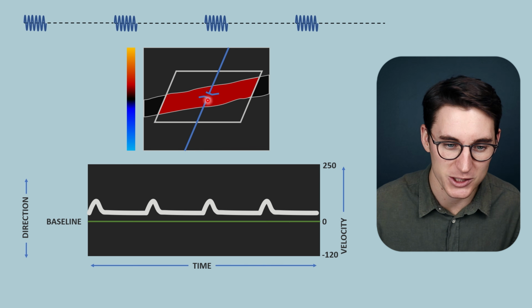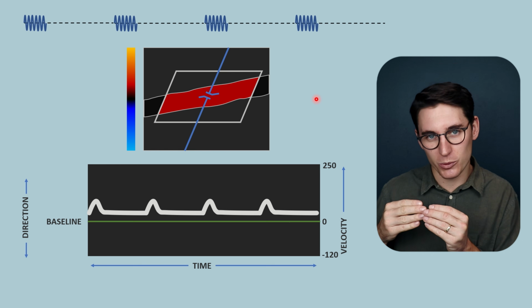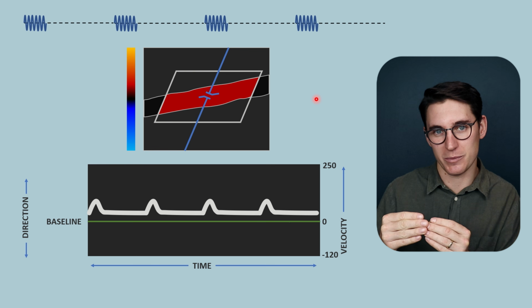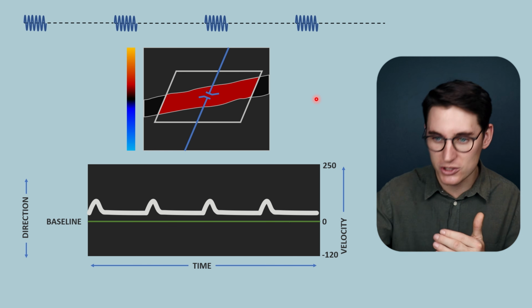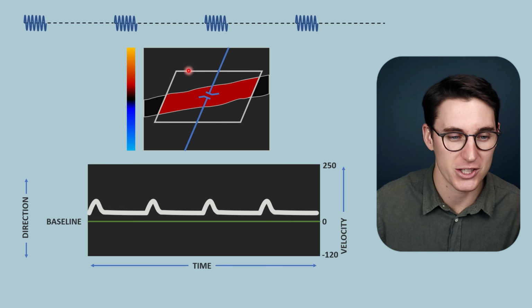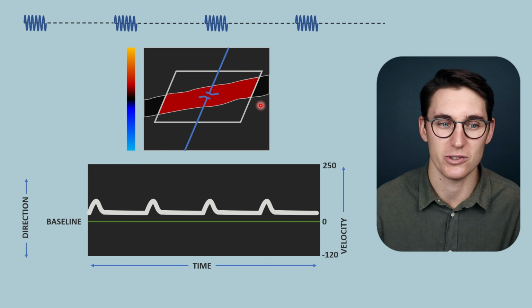So say for example this was 4 centimeters deep in the tissue. We can then calculate how long it would take our pulse to go 4 centimeters in and return 4 centimeters back before then releasing the next pulse into the tissue. That's what's known as our pulse repetition period. Now here our pulse repetition period has been set because of the depth that we are sampling within tissues.